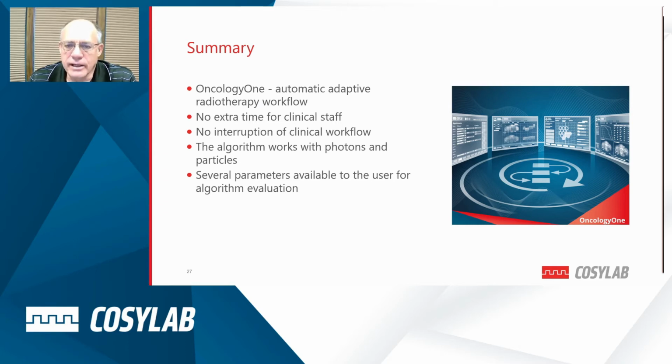And so you have to go in and evaluate, you have to bring into the planning system the cone beam CT data, or the quality CT that was done on the axial scanner. Then some treatment planning systems allow you to streamline that process a little bit to put the existing plan onto the new data set, and you have to calculate, then you have to manually evaluate, look at the clinical goals. It's a very tedious process.